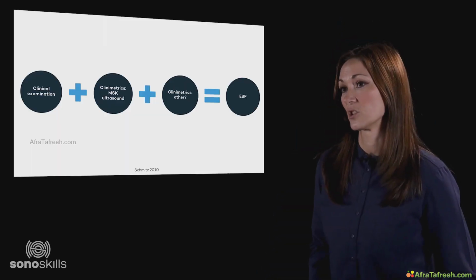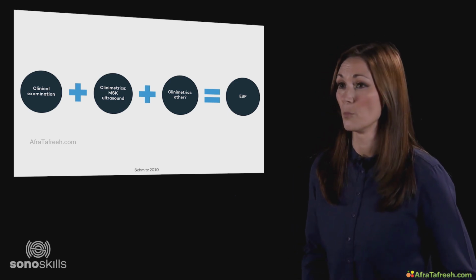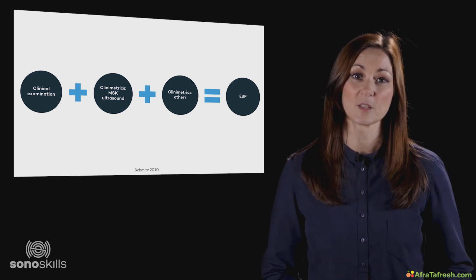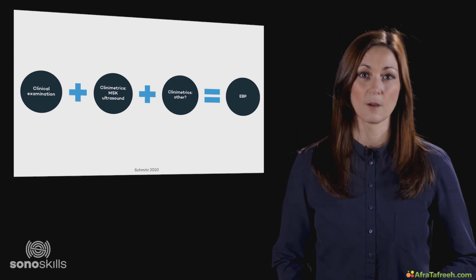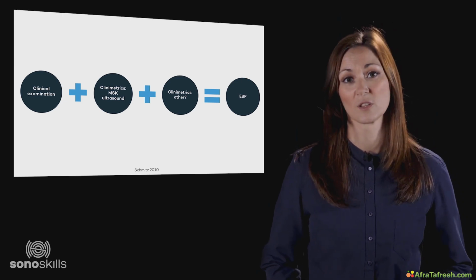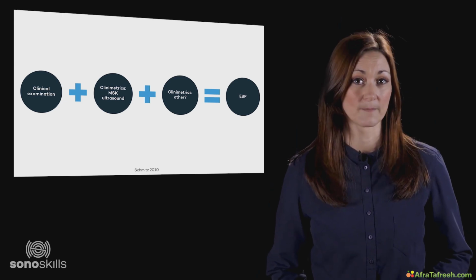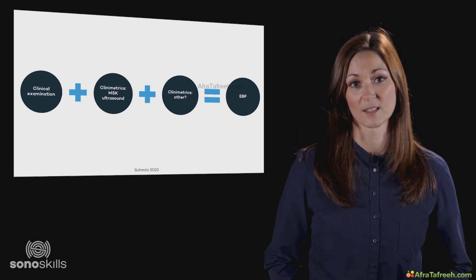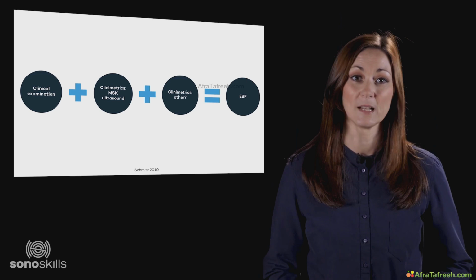In the previous images, you could see how ultrasound is able to demonstrate the specifics of a pathology more so than a clinical examination test could ever show. These specifics are important for your clinical reasoning and your therapy choice. But in theory, all these patients could have been asymptomatic. The findings could have been false positives. So to exclude these false positives, you will have to include your clinical examination tests. These are needed to see if the ultrasound findings are really clinically relevant.